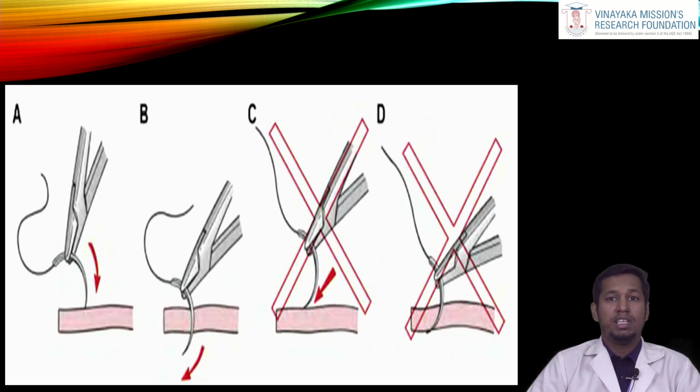The needle is first inserted into the outer surface of the buccal flap and then the lingual flap. Then we cross over. The needle is again inserted in the same fashion but at a horizontal distance on the opposite end, and then both ends are tied together to finish the figure of 8 knot.